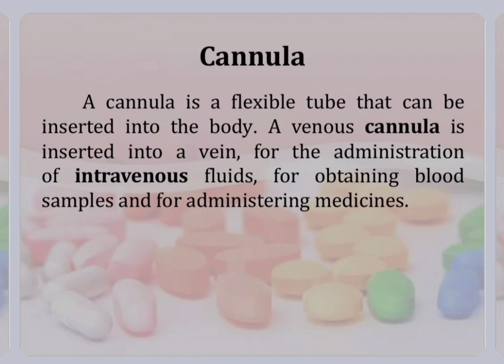When it comes to IV lines, we have two types of IV lines. One is the central IV line, or central venous line, you can say. Then after that we have the peripheral venous line.